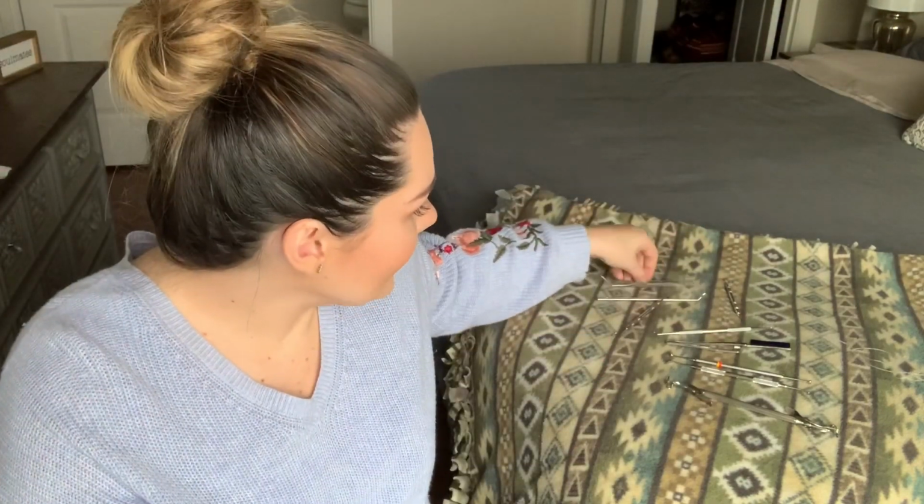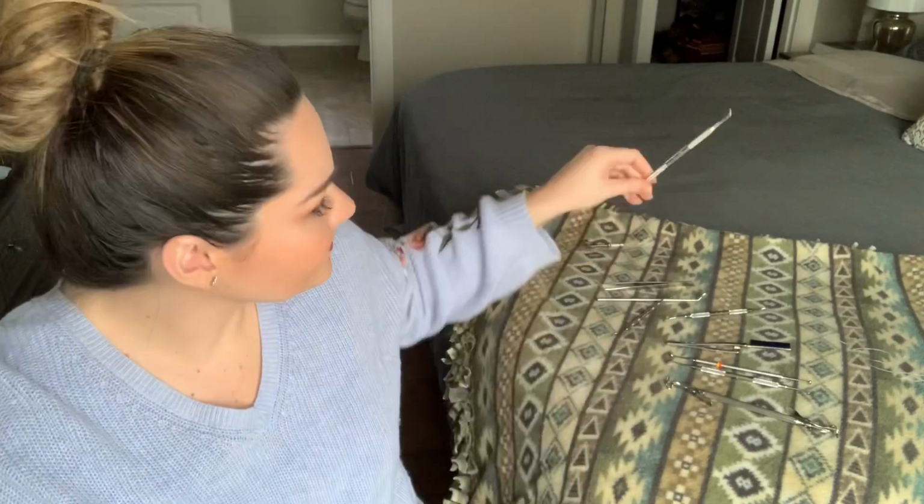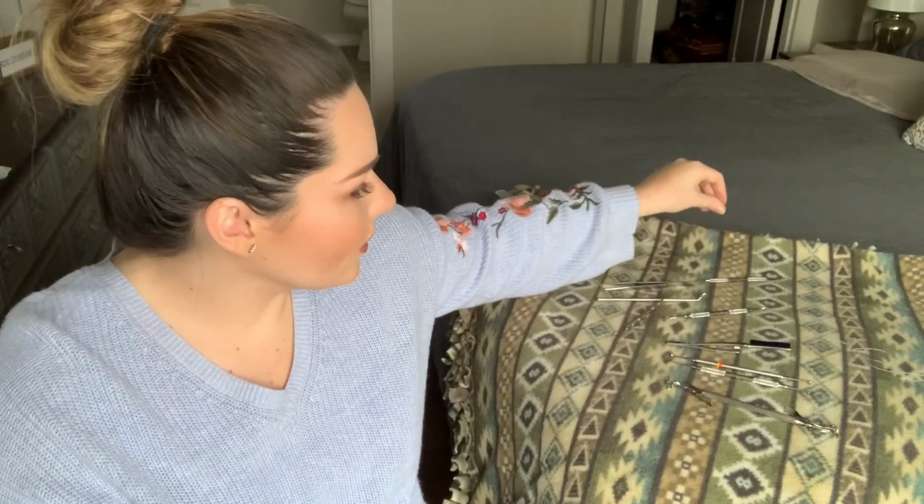And then I always hand my dentist the ball burnisher. So this guy here, after he's placed the matrix, because they will put that in there and kind of shape the contacts and make sure that the contact is there properly and that's on the gum line, so the material's going to the gum line. So they'll kind of use this to shape the matrix a little bit, so I always hand them this. And then we're gonna get into the filling.